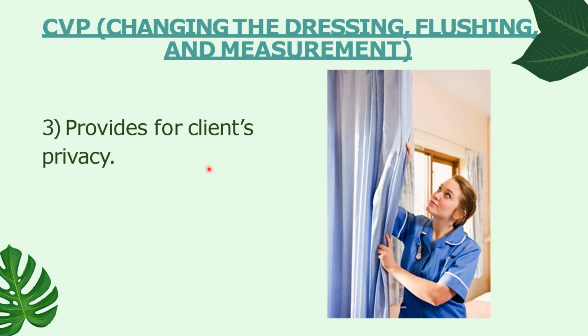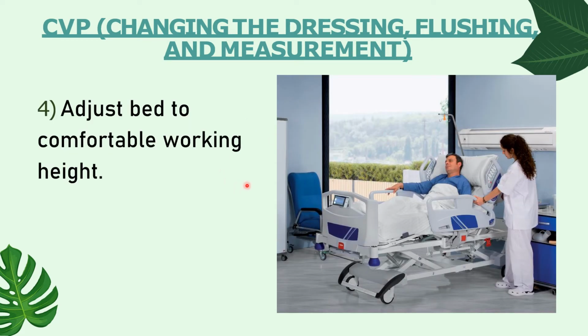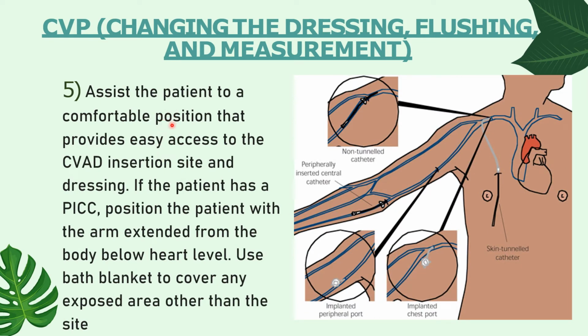And then you can provide for the client's privacy. Of course, this is for the comfort of your client. Then you can adjust the bed to a comfortable working height for you to easily perform the procedure. And then assist the patient to a comfortable position that provides easy access to the CVAD insertion site and dressing. If the patient has a PICC, you have to position the patient with the arm extended from the body below the heart level, as you can see in this picture.